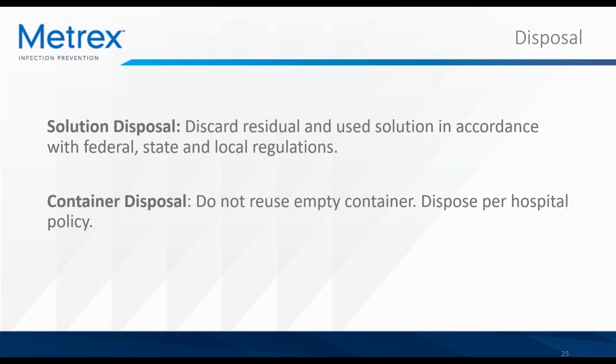Disposal is another topic we're asked about often. When it comes to disposal of the solution, the requirements are going to vary greatly for each facility. Your local water authority should be your best resource, as they'll understand the intricacies of your city's particular sewage system and the chemicals that may require neutralization before being introduced to the waste system. The container should not be reused, but it is recyclable. Dispose of the bottle in accordance with your hospital policy.